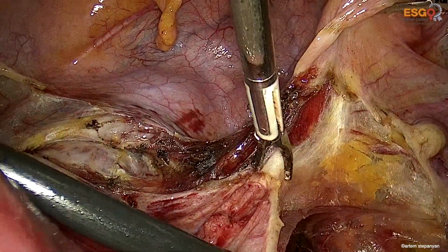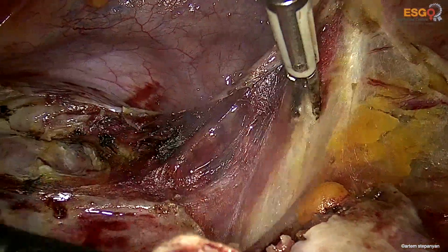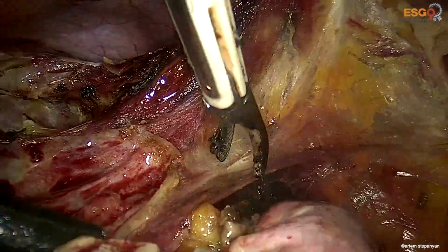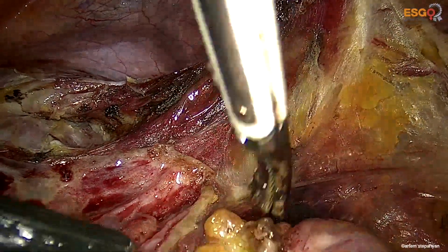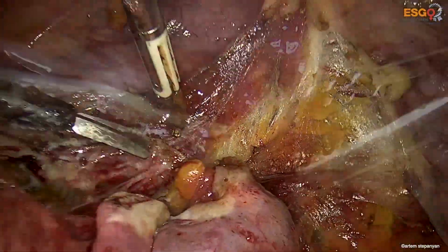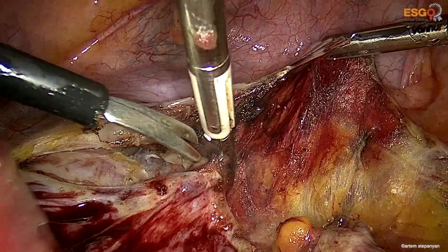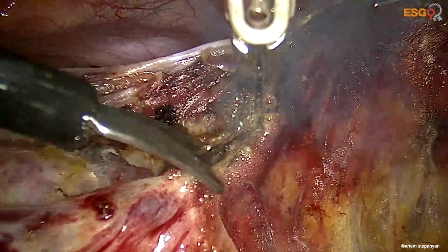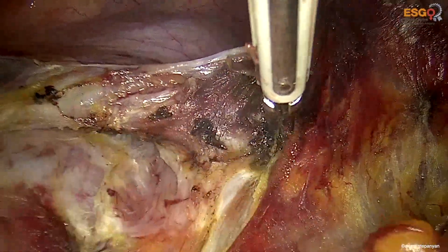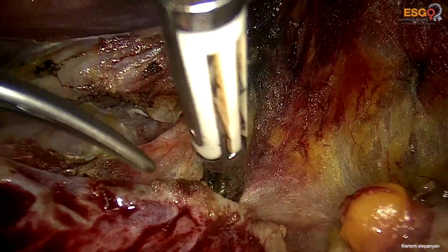And since the incision of the anterior broad ligament modified a bit the standard approach to laparoscopic hysterectomy, we enter a bit closer to the bladder, and here we keep the control over the bladder wall and try to be closer to the peritoneum to avoid the cystotomy at this step.